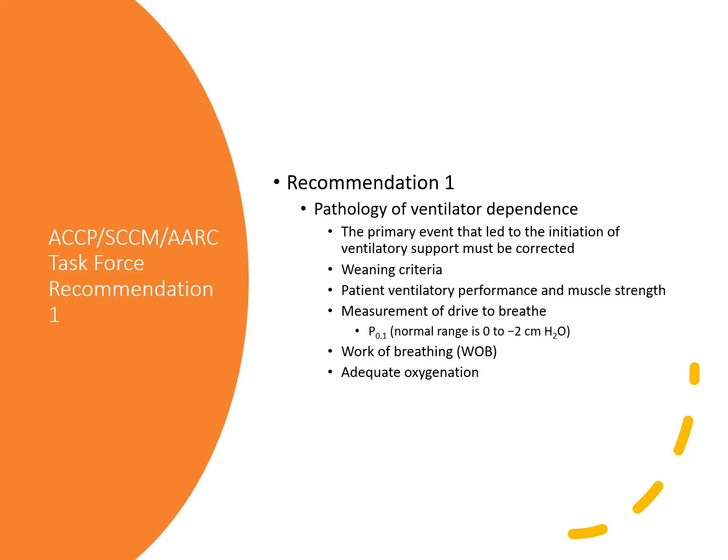Let's say that someone's in heart failure and their ejection fraction is still, let's say, 20%. Not good, right? How successful do you think they'll be at weaning, right? So we're unlikely to be successful if we don't have that either mostly reversed or reversed. So their recommendation is that all the causes for being on the ventilator might be contributing to ventilator dependence. So we should look at what caused them to require that ventilator and make sure it is reduced or treated before we consider weaning or extubating them.